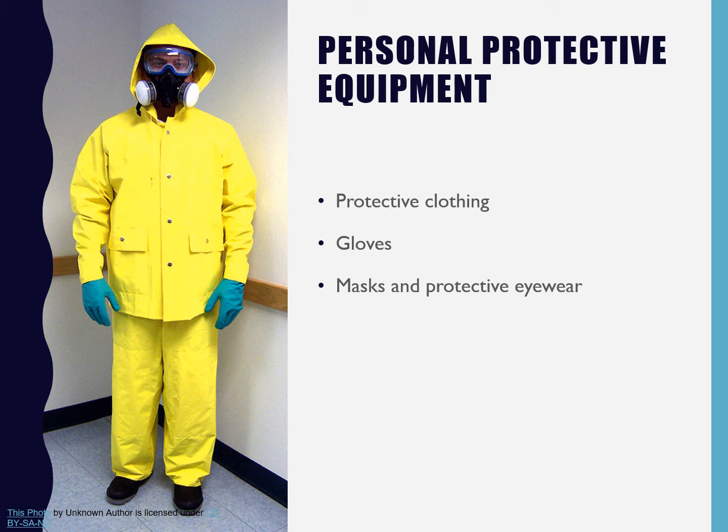These actually came out in the 1980s, and so you'll see some dentists, some professionals, are still out there that have been around since before the mid 80s, and they actually practiced without gloves before that. And so this is one of those things that you'll hear of people who practice without gloves.